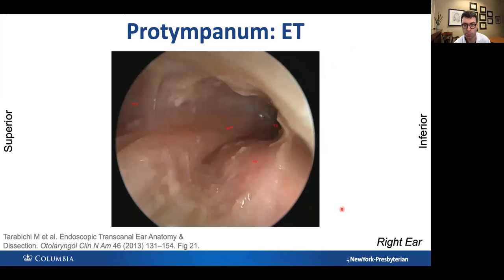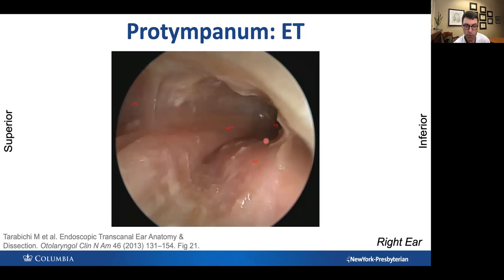Now let's talk about the protympanum. The really only important thing in the protympanum is the eustachian tube. Here's the eustachian tube orifice. Within the opening of the orifice, we can often see the carotid artery impression, and then we can see the tensor tympani muscle.